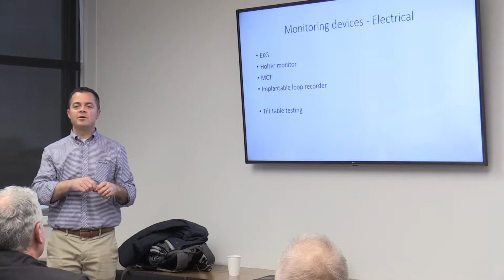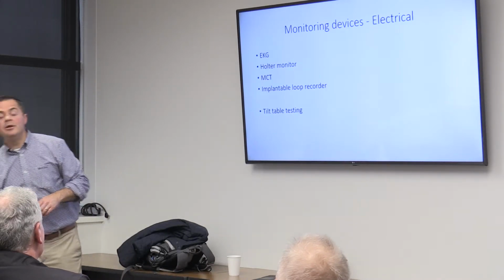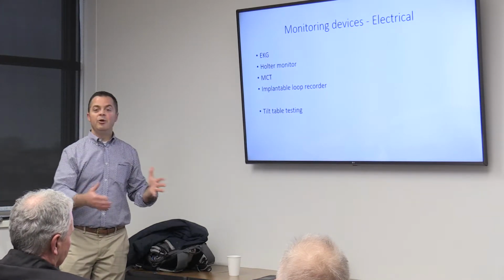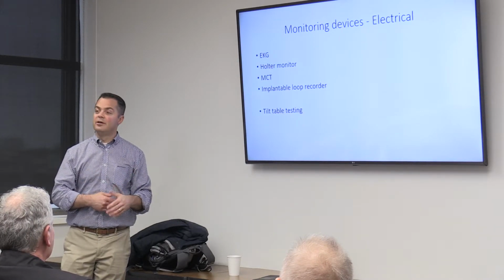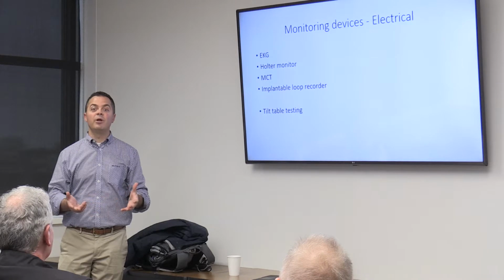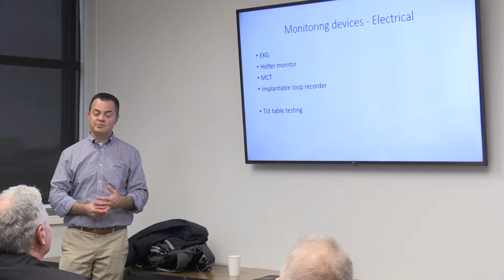And that thing parks there for a couple of years. And it collects all this data. And it notifies us when you're having troubles, and you can tell us, hey, on Saturday at 4:30, I felt terrible. My heart was racing away at me. What was going on? And then we can go in and look, and the device will tell us.